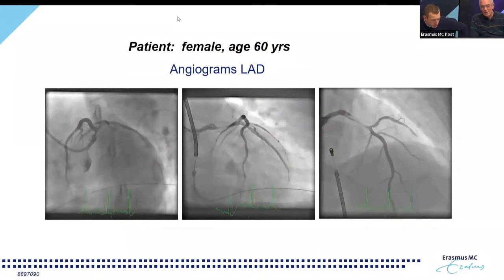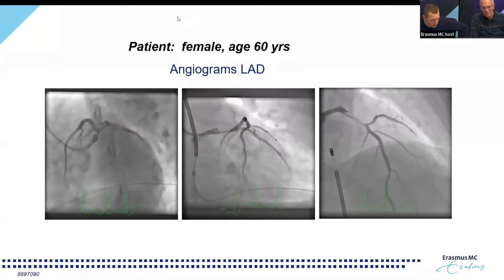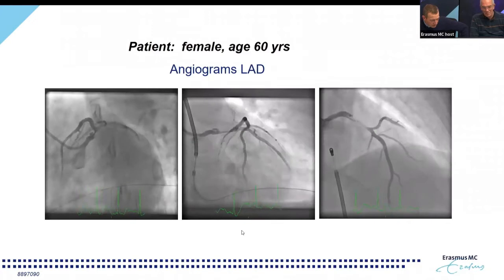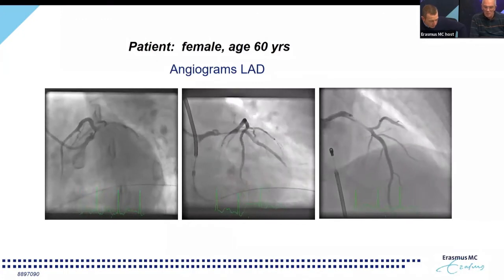So here the operator had to deal with a patient that was at that time hemodynamically unstable and had a left main that was only very, very thin in an area which we already knew was dissection and hematoma, so a risk of ending up in a false lumen.